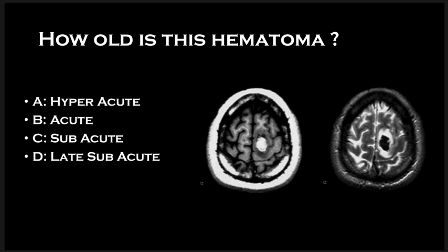So this is probably the most common, this terminology of hyperacute, acute, subacute, late subacute, chronic. Those are words that people who write multiple choice questions like to use. Those are words that are all over the radiology literature. Some other ways they could do it is by giving specific time frames in hours or days. And then you have to know, well, which one of those is hyperacute or subacute.